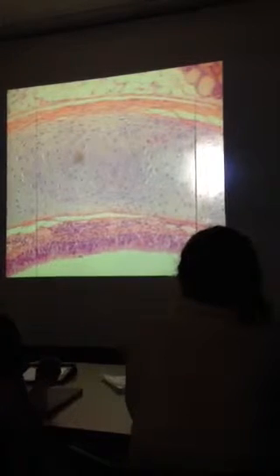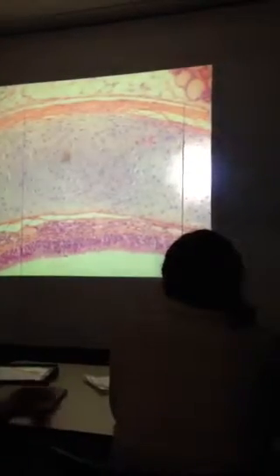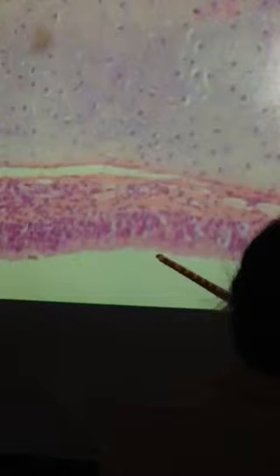Okay, what are we looking at? This is hyaline cartilage, possibly of the trachea, because there's your thyroid gland. You got thyroid gland, you have adipose tissue, you've got hyaline cartilage, you've got submucosa, you got the mucosal lining, and this is very out of focus, but you know that's pseudostratified ciliated columnar epithelium, okay? So again, I would know hyaline cartilage, and then what's the pink area right there?